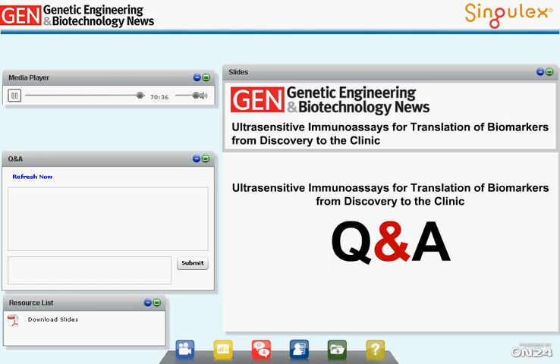This is Corinne Solier. Maybe I can bring a perspective on that question. I think it is absolutely possible. It's very much reflecting the current view on multiplex immunoassays, so that it's a flexible platform offering the option to measure multiple candidate biomarkers where you have a variable level of confidence, and when you are more informed on the validated state of these biomarkers, you would like to use a more robust assay, and then move to another more robust platform like Singulex ELISA or Singulex or other platforms that offer more robust features.